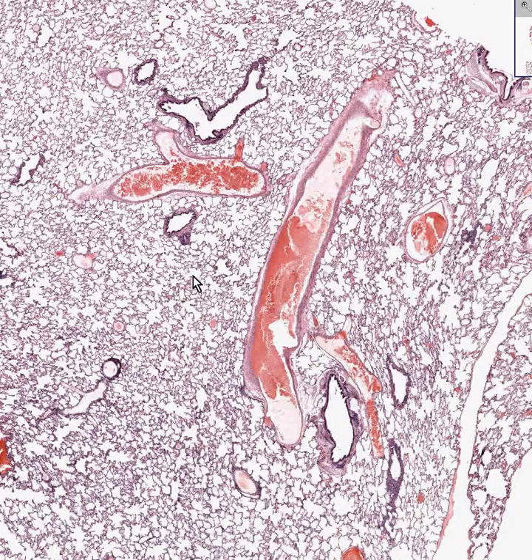When we look at the alveoli, you'll see the smallest level of vascular spaces. You'll see capillaries. The air spaces consist of bronchi, bronchioles, respiratory bronchioles, alveolar ducts, and alveoli, going from the larger to the smaller structures respectively.